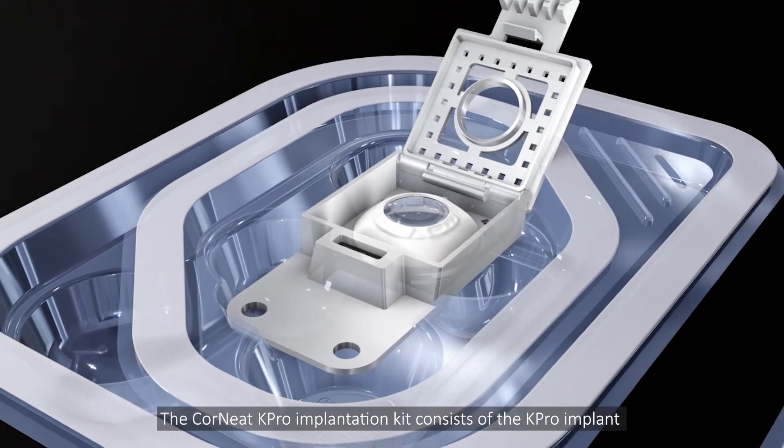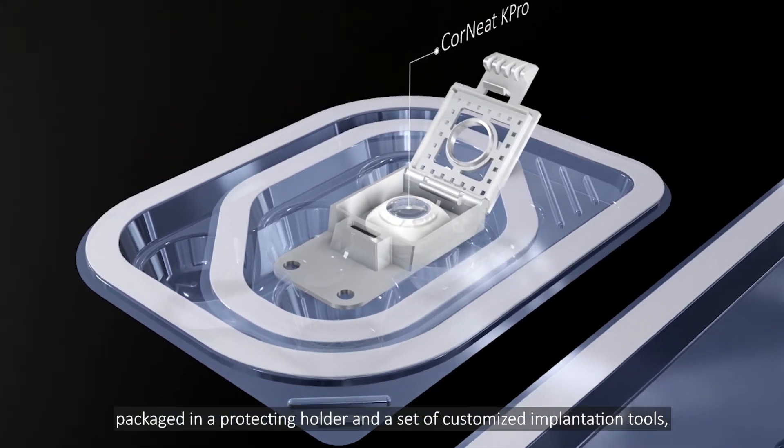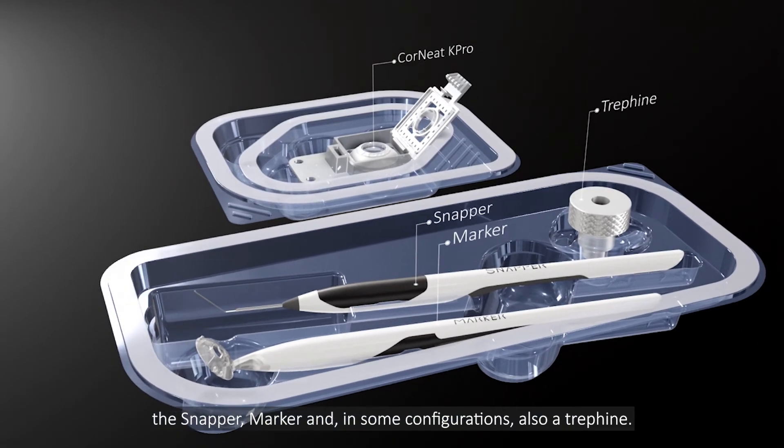The Corneat K-Pro implantation kit consists of the K-Pro implant, packaged in a protecting holder, and a set of customized implantation tools: the snapper, marker, and in some configurations, also a trefine.